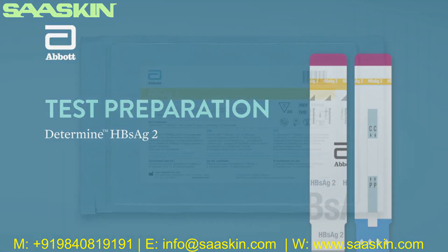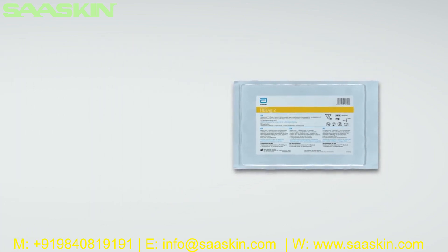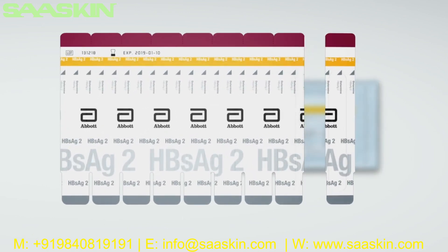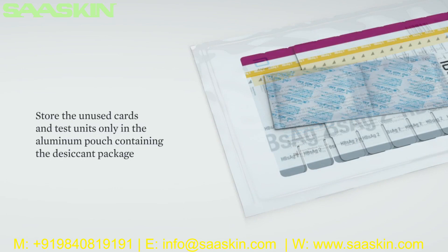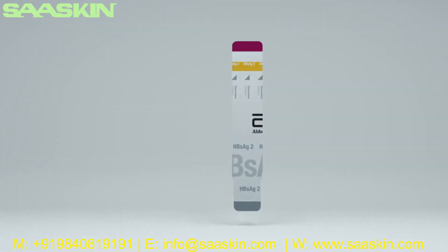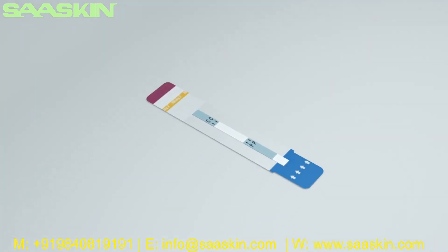Test preparation: Open the aluminum pouch containing the Determine HBsAg2 cards. Remove the desired number of test units from the 10 test unit card by bending and tearing at the perforation. Removal of test units should start from the right side of the card to preserve the lot number, which appears on the left side. Store unused cards and test units only in the aluminum pouch containing the desiccant package. Carefully close the Ziploc so that the cards are not exposed to ambient humidity. Remove the protective foil cover from each test unit and lay it flat. The test should be initiated within 2 hours after removing the foil cover. Do not touch the sample pad.